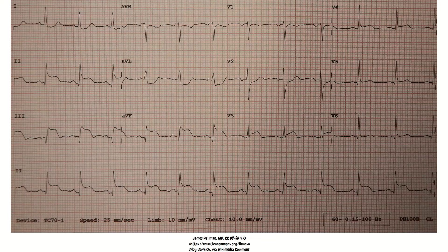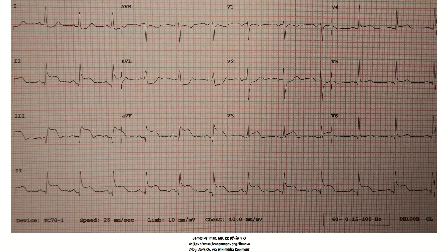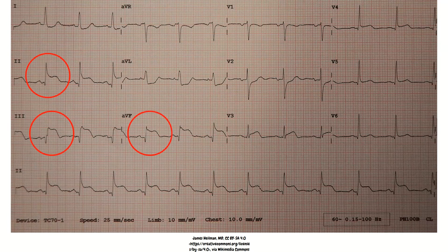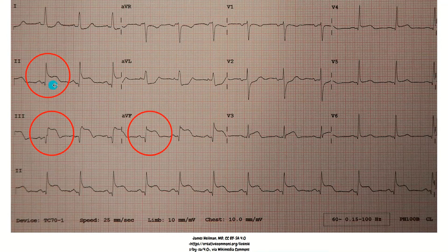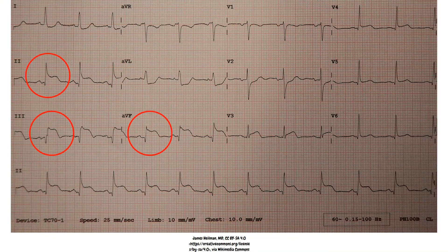Now that you know what the ST segment is and that you're looking for elevation in consecutive leads of one to two millimeters, let's look at this EKG and see if we're seeing any ST elevation. Pause the video if you want to look first. Comparing the PR segment, we can see ST elevation in leads II, III, and AVF. This is lead II — here is the PR segment, and if you follow it straight, the ST segment is elevated above it. There is ST elevation in leads II, III, and AVF, which are consecutive leads corresponding to the inferior part of the heart.